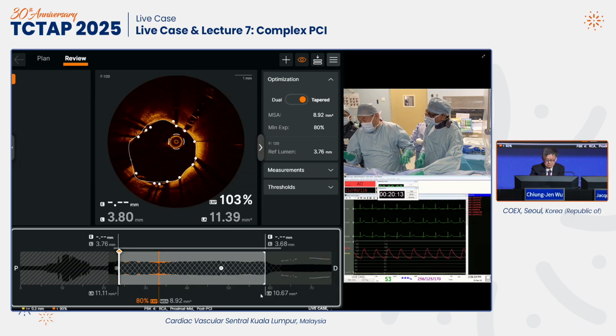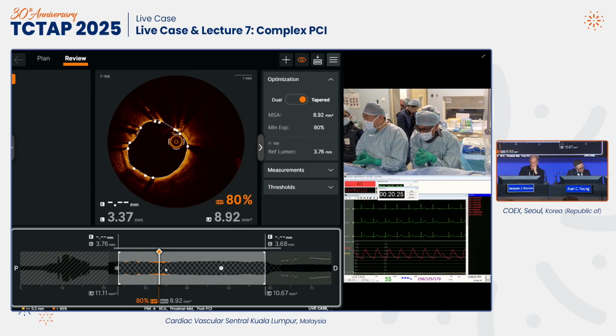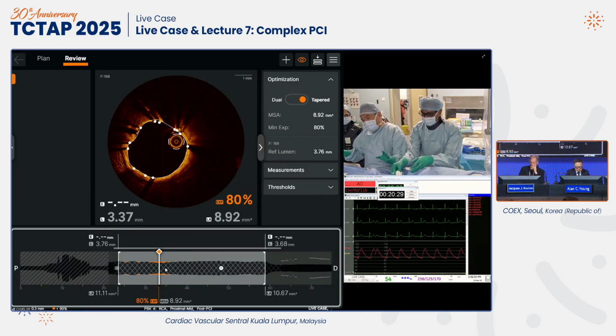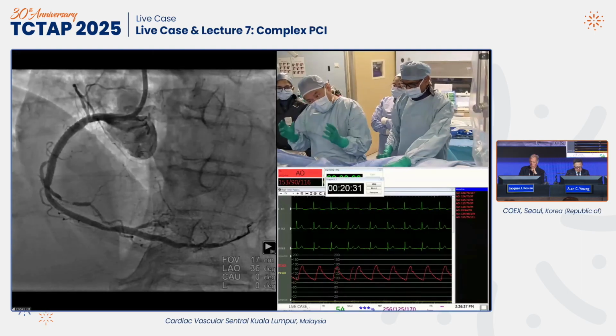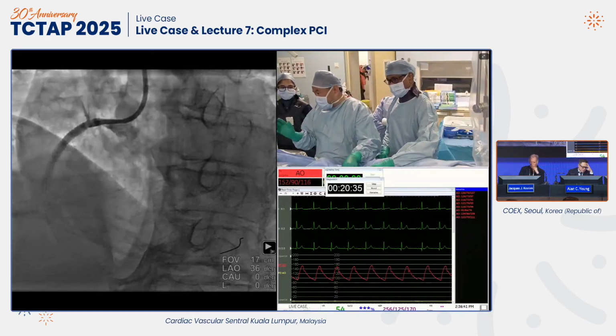In 2 cases, we had difficulty trying to dilate, that we could not dilate, and we didn't want to use very high-pressure balloons because we felt that it's not going to give us good results. So we did go to 20 atmospheres. It didn't fracture. Then it gave way, and we were able to then treat with other stents or DCB.